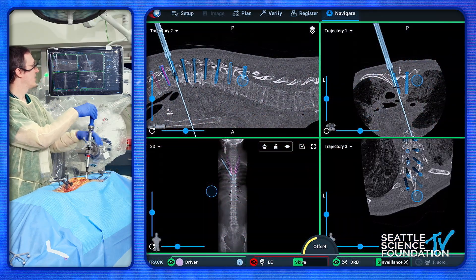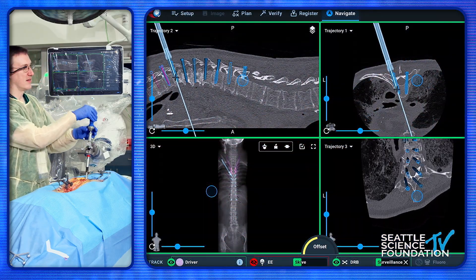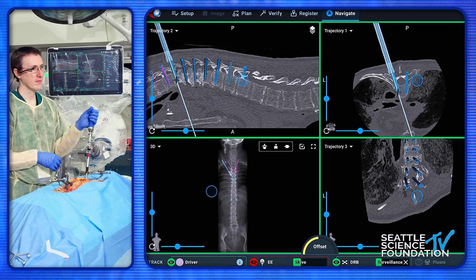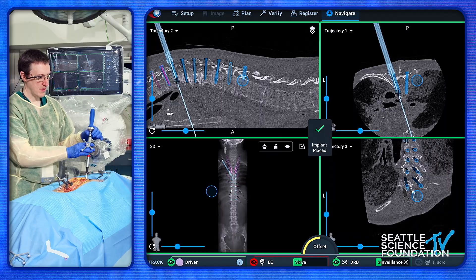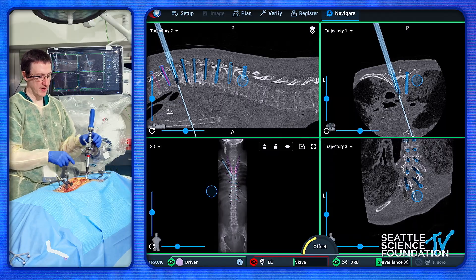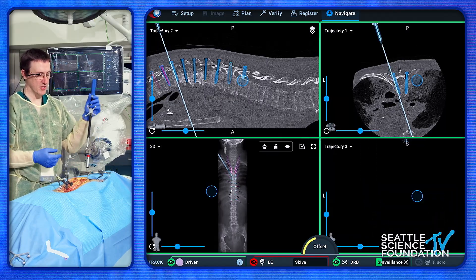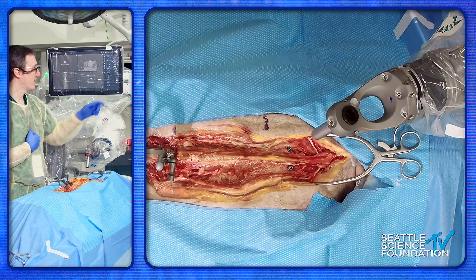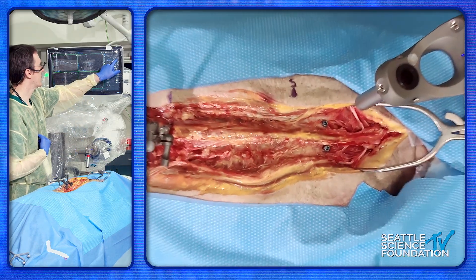We can see the screw coming down and we're following the plan that we had. When we say serpentine, the next one I would do — just a matter of efficiency — I'm going to go to the next one down on my side, and then hand it back to Dr. Minasalli.